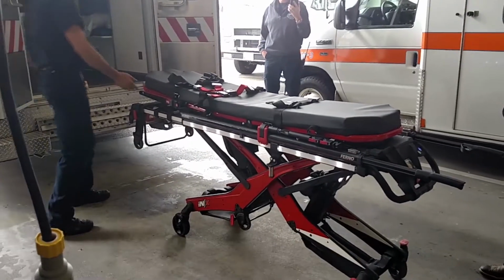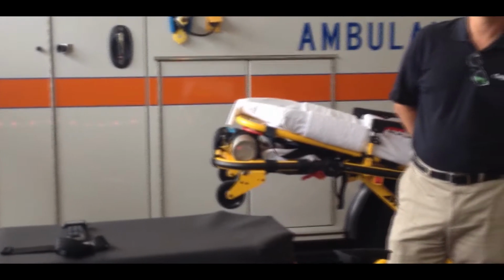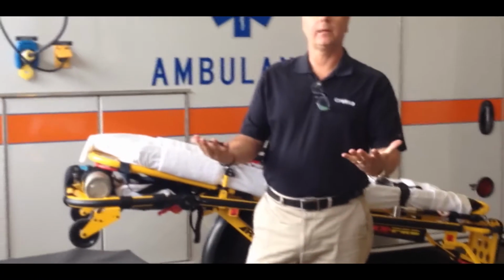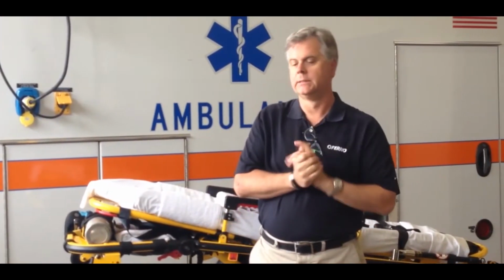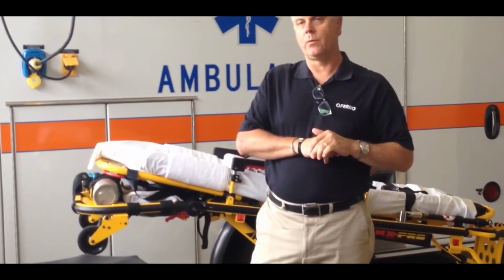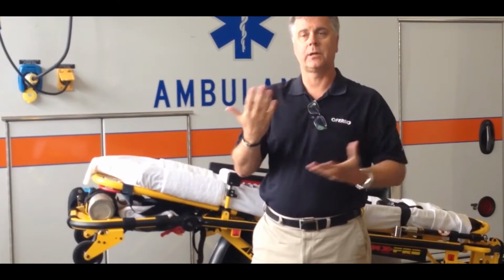That's pretty impressive. How long does the battery last on this? So battery is typically a how often and how heavy kind of equation. With what we call an average height and weight person, you're going to get about 26 cycles. One up and down is a cycle. It's a lithium-ion battery. You have two charging options. One is an AC power adapter that you would have inside the vehicle with another battery, so you would swap it out after each call if you wanted to. The other is an integrated charging system where if the cot is in its fastener while it's plugged into shore power, you're continuously topping off your battery as you drive down the road. So you're always going to have a topped off battery.